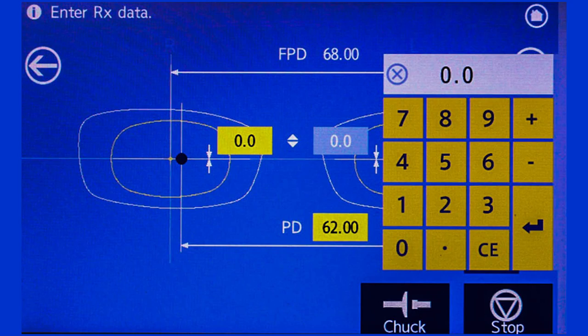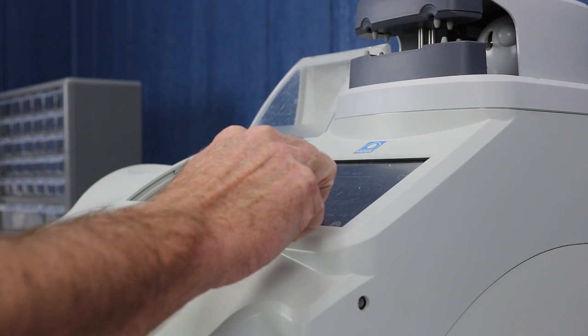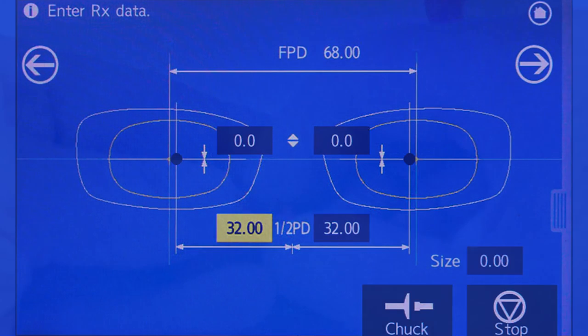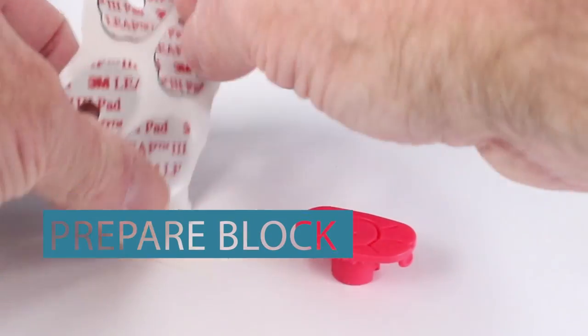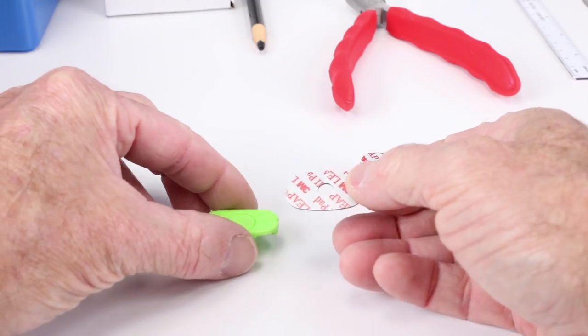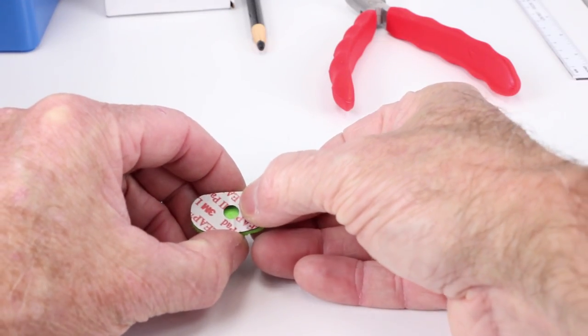Next, because this is a basic single vision job, you may decide to change the OC height. So you would use this screen to do that. Next would be PD, which obviously can be done either in a monocular setting or a binocular setting. And that would be a great time to prepare a couple of blocks, because the next step after this is going to be applying the block to the front of the lens.